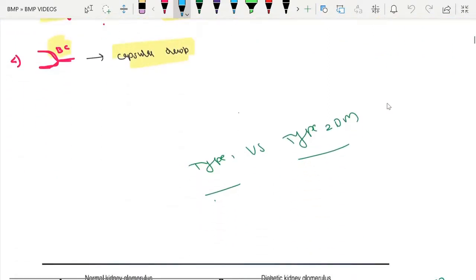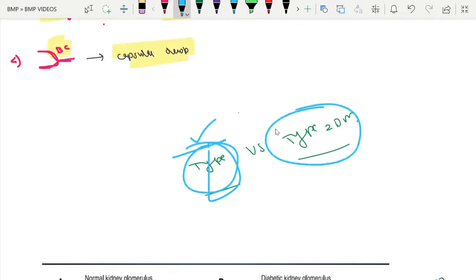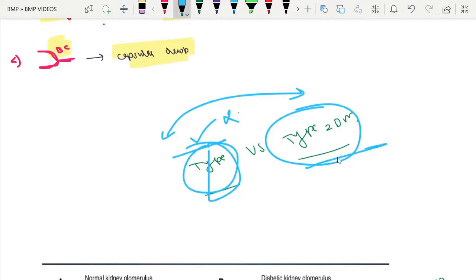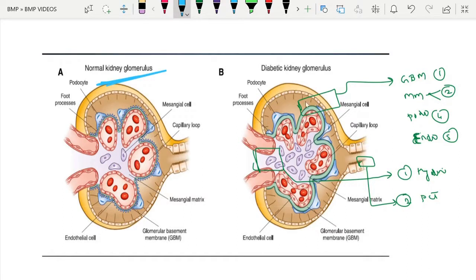To summarize, the first finding is GBM thickening, and the most specific finding for diabetic nephropathy is afferent and efferent arteriolar hyaline accumulation. Regarding differences between type 1 and type 2 diabetes, in type 2 the findings are heterogeneous — based on biopsy findings alone, we cannot differentiate between type 1 and type 2 diabetes.